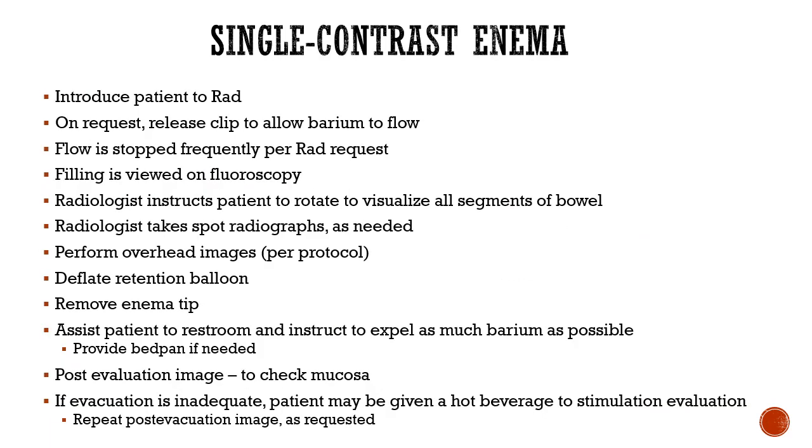For the single contrast enema, we're going to introduce the patient to the radiologist. On request, release the clip to allow barium to flow. Flow is stopped frequently per the radiologist's request, and we want filling as viewed on the fluoroscopy. The radiologist instructs the patient to rotate to visualize all aspects of the bowel. The radiologist takes spot radiographs as needed, and they perform overhead images per protocol.